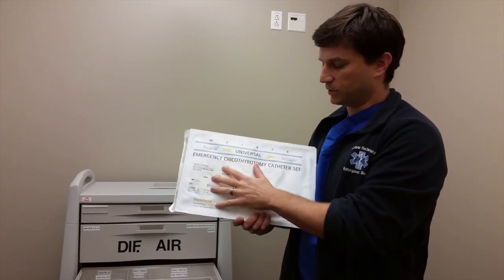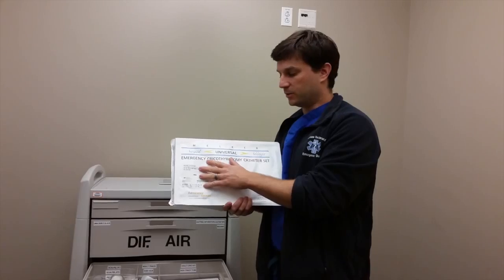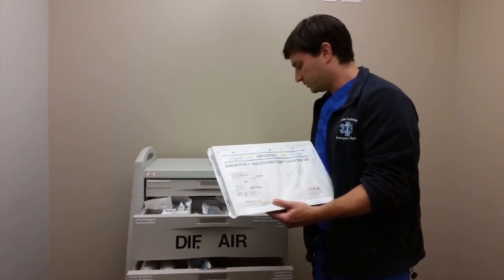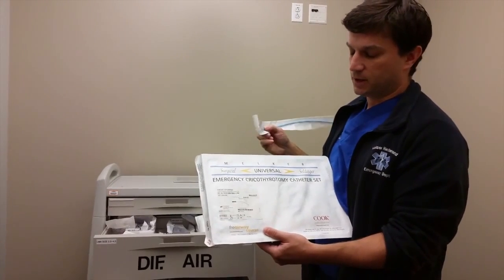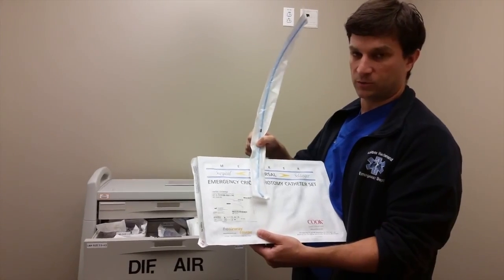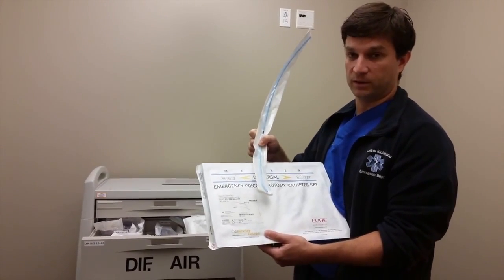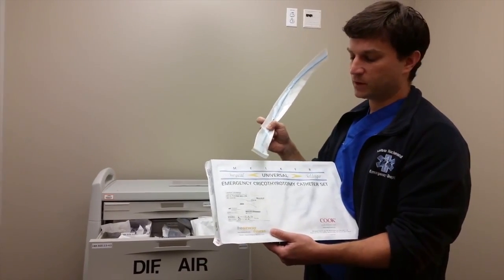One thing that often goes along with this, one technique that we've been trained to that helps a lot when doing the open airway, is that once you incise through the cricothyroid membrane and make the hole, you can actually use your bougie to secure your place in there. Because one of the dangers of doing the surgical technique is that if you don't have a very secure, clean way into the trachea, if you have an obese neck or whatnot, sometimes you can end up putting your tube into the pretracheal space and creating a false lumen. And then you're not ventilating the patient, you're just creating a lot of mediastinal air and trauma.